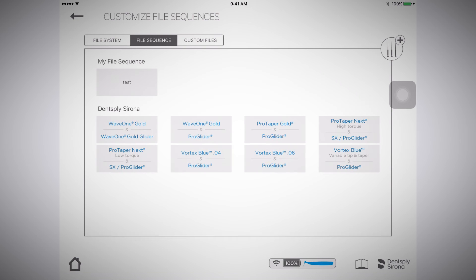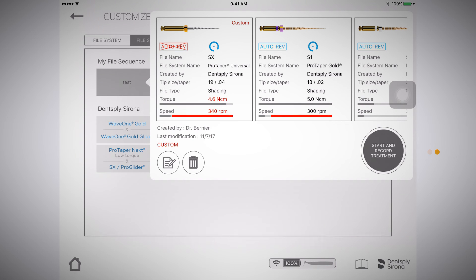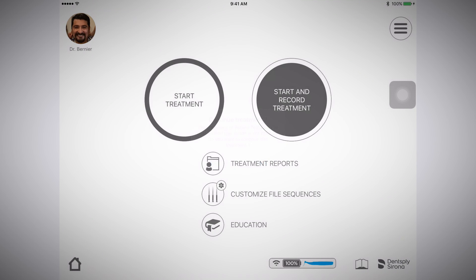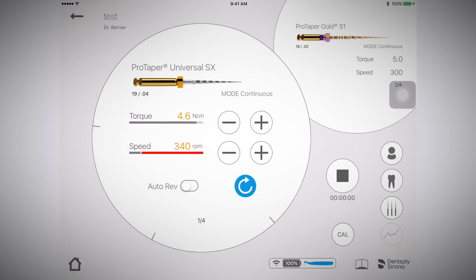You will now find it under the My File Sequences section. To use the custom file sequence, either select it on the Customize File Sequences page and press Start and Record Treatment, or go back to the home page and select Start Treatment or Start and Record Treatment.